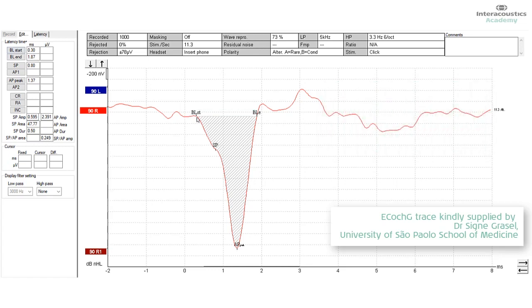So we draw a horizontal line across the waveform beginning where the baseline or the SP starts to where it intersects the waveform again. And that point will represent the same amplitude spot as the amplitude at the start.